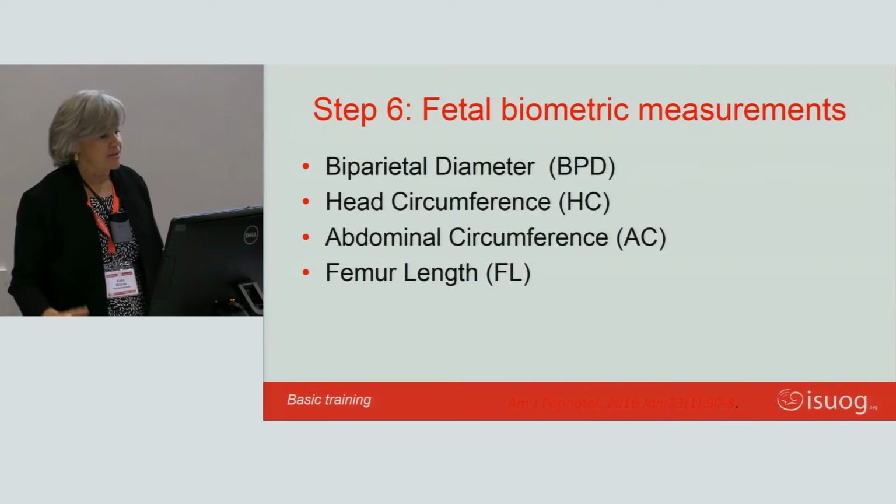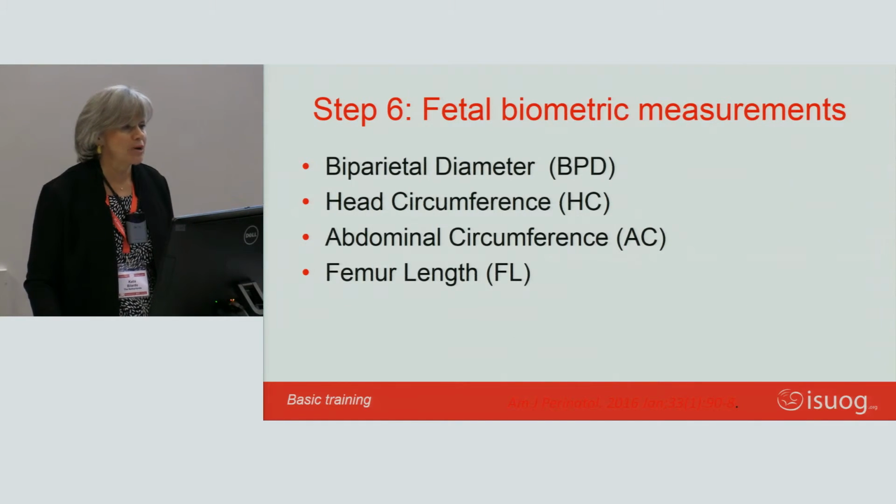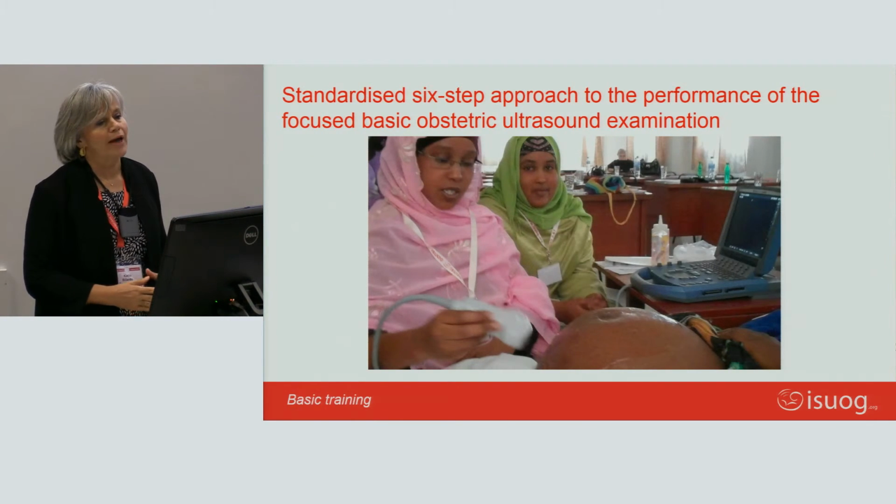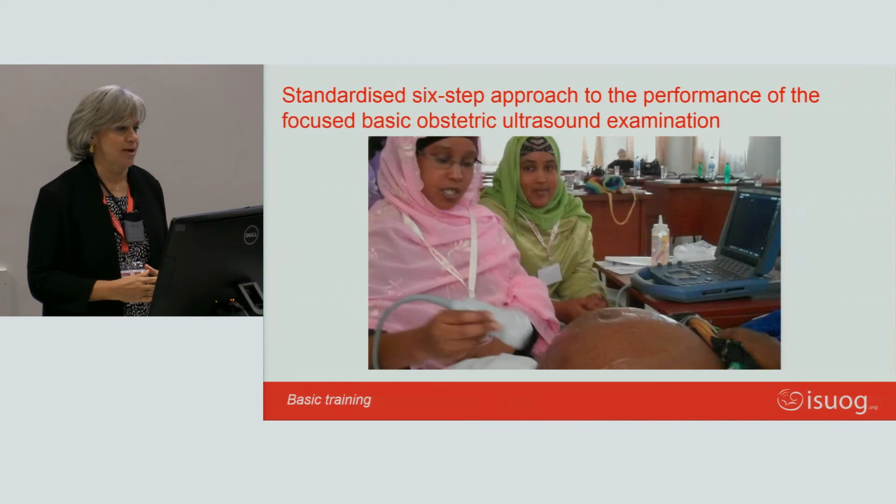And then the 6th step is the biometry, fetal biometrical measurements. But as I told you before, I'm not going to talk on this because it will be the subject of another lecture. So we have used this approach to teach people who haven't got any experience with ultrasound.